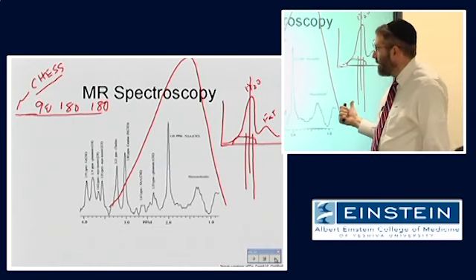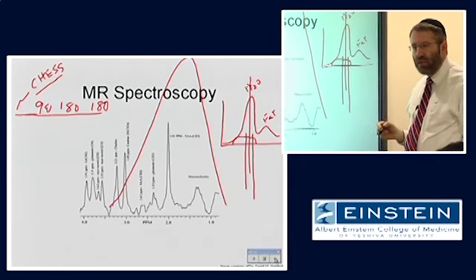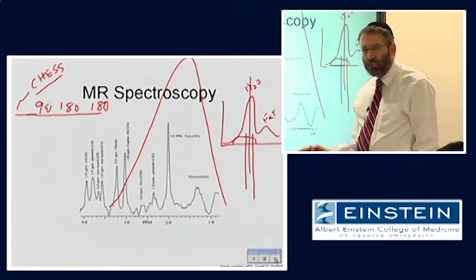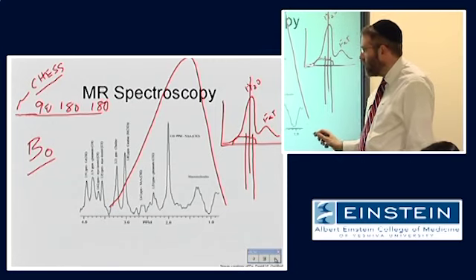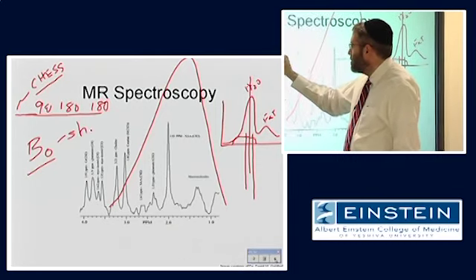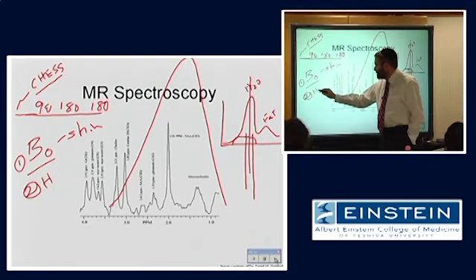So a key step in doing MR spectroscopy is first, as we discussed before, having no gradient magnetic fields, right? If that frequency encoding gradient would have been on, we wouldn't have been able to tell the chemical shifts of the molecular populations here because we would have been corrupted by that gradient magnetic field. Similarly, we have to make sure that our B0 is as homogeneous as possible because any variability in the static magnetic field will cause changes in precessional frequencies that have nothing to do with the chemical shifts. So shimming and having a very homogeneous magnetic field is the first thing that we have to pay attention to in doing MRS. And the second is water suppression, without which we're never going to see this information.